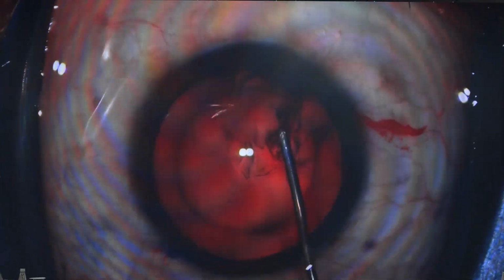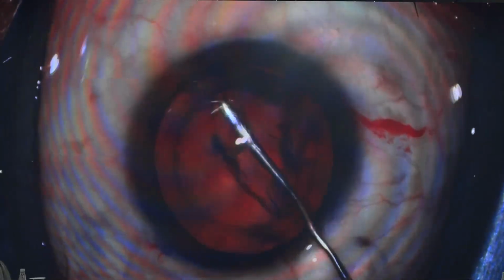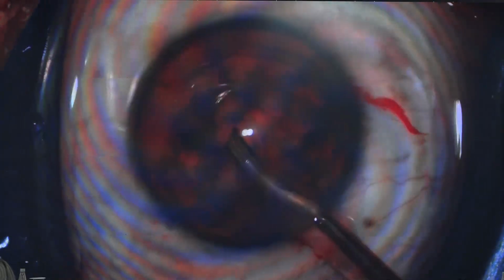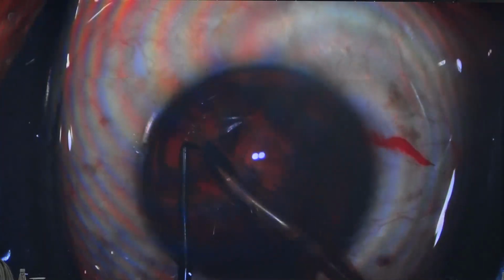Hydro procedure should be gentle because you know that the anterior chamber may fluctuate, and in these cases, later on you have a harder nucleus, but generally they present to you earlier. Phaco settings, just as I pointed out: the IOP should be low, AFR should be on the lower side, and the vacuum should not exceed 400 millimeters of mercury.